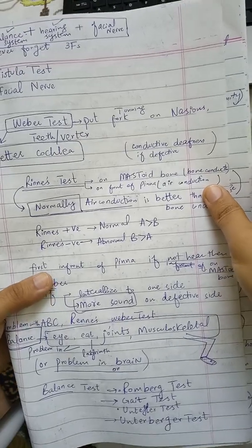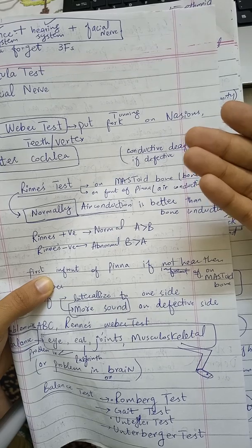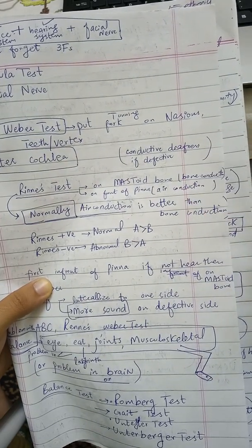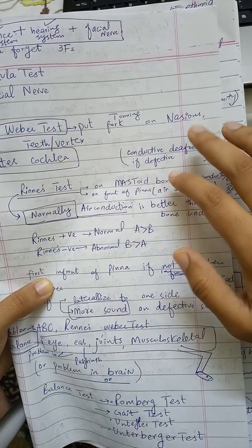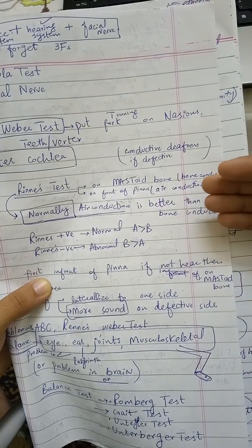And then Rinne's test. In this test we put the tuning fork on the mastoid bone first, and then in front of the pinna, to detect bone conduction and air conduction. On the mastoid bone we detect the bone conduction, and in front of the pinna we detect the air conduction.